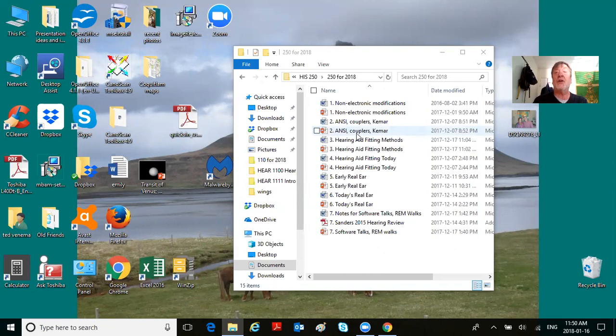You're going to see what they call real ear to coupler difference. And when you see an ANSI response, ANSI stands for American National Standards Institute. You've got ANSI specs for glasses, ANSI specs for bells. You got ANSI specs for everything. Probably ANSI specs for oyster shells. No, I'm just teasing, but you know what I mean. ANSI specs are for vision, everything, okay? ANSI specs for electrical outlets, everything. So ANSI specs for hearing aids. And we will go through 5 ANSI measurements.